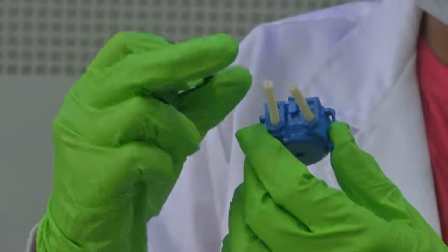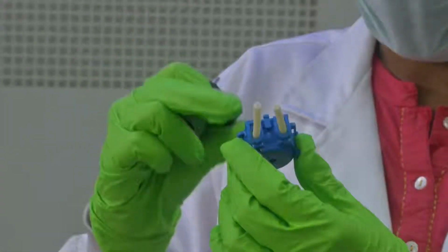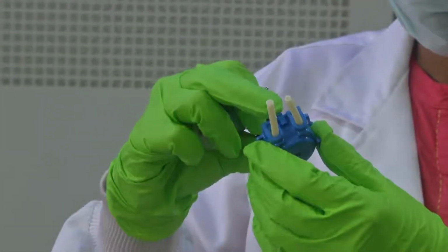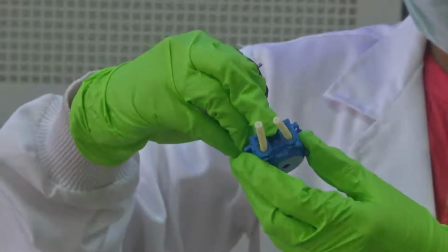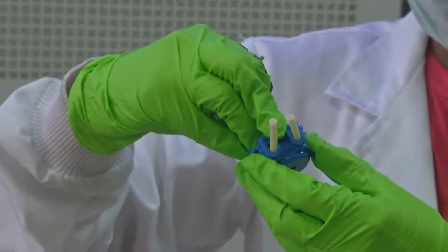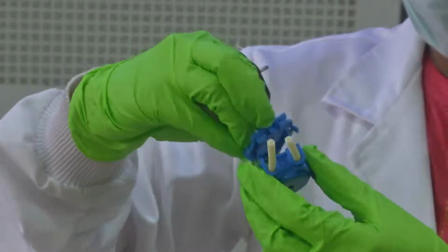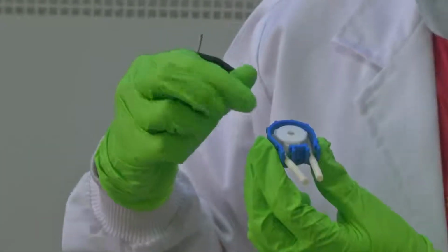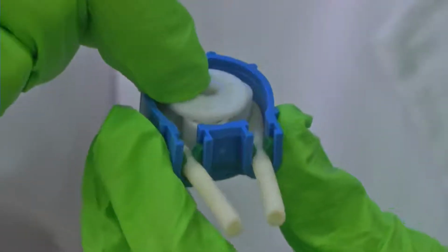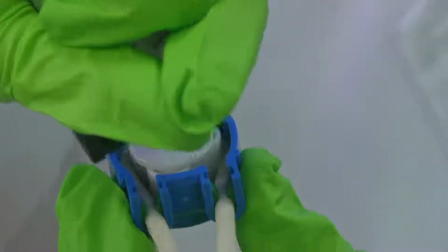This is the tubing through which the fluid flows in and then comes out. Let's say I remove the casing. If you could see this, this is where the motor drives in.